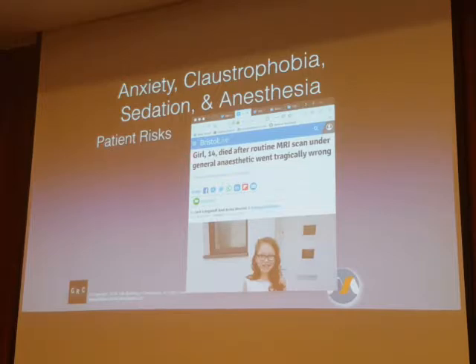Who's going to take care of it? Where are we going to respond to this patient's clinical concerns? Do we have a space designated for anesthesia care where we can actually ventilate the patient, bring supplemental oxygen? How do we care for this patient? In this facility, they really didn't appear to have those kinds of plans or infrastructures in place. I raise this because it's not just a question of, do we have an MR conditional anesthesia machine? It's, have we planned for how we're going to take care of these patients if things go badly?